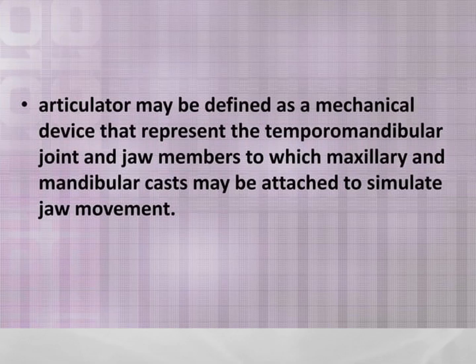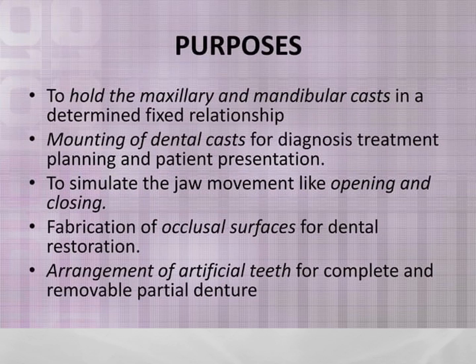Articulators. Articulators are defined as a mechanical device which represents the temporomandibular joint and jaw members to which maxillary and mandibular casts can be attached to simulate jaw movement. What are the purposes of an articulator?